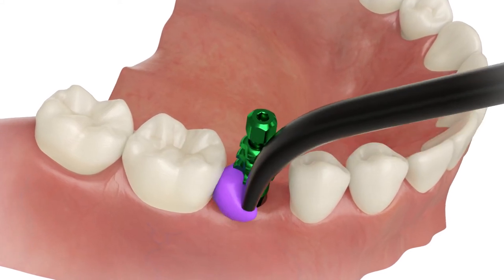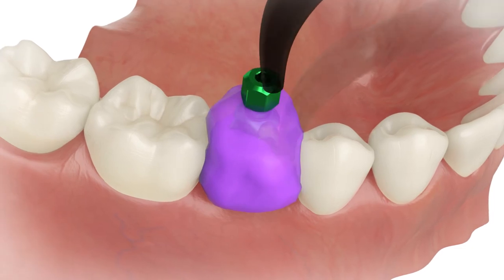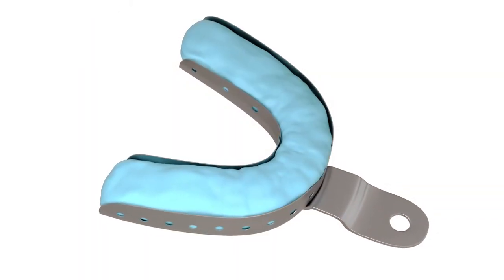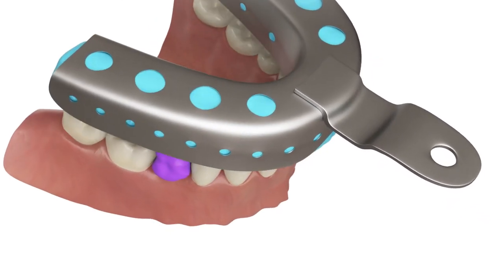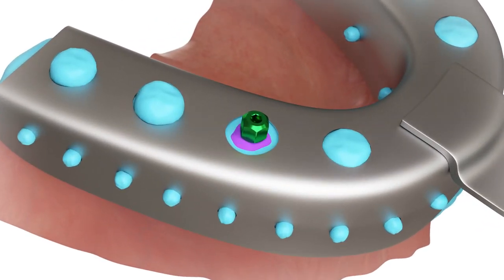Inject impression material around the transfer. Fill the impression tray with impression material and seat the impression tray into the mouth. The screw extends behind the impression tray.